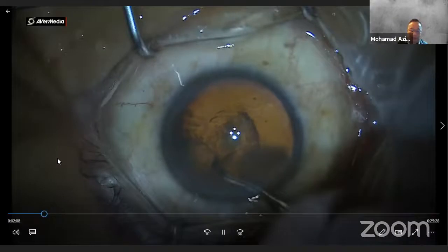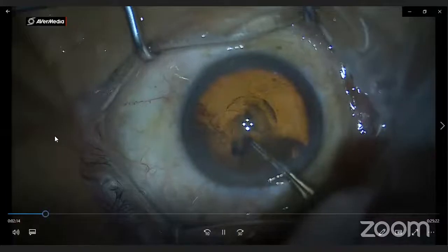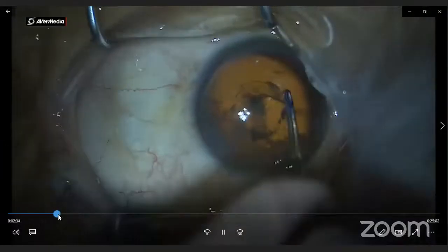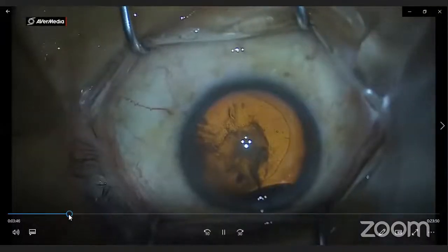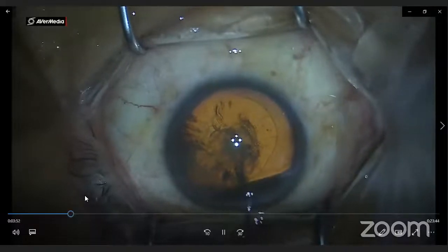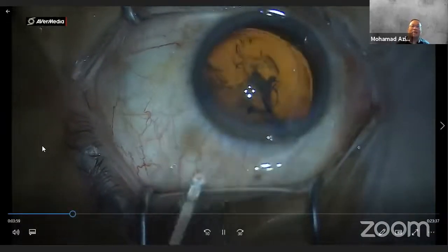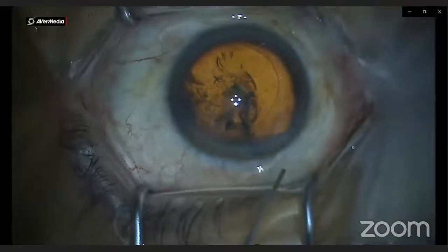Slow but safe is okay, Mani. Kalau laju pun unsafe, there's no point kan. Saya lajukan sikit lah kot, because too slow. Then proceeded with the hydrodissection. Saya ingat atas tu jadi besar sikit. Dia betul-betul dekat ada border, tapi it's not extended lah.